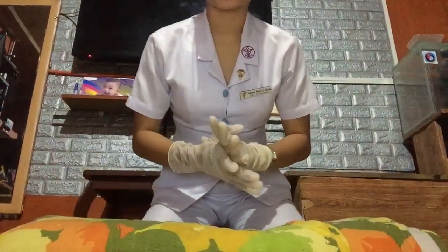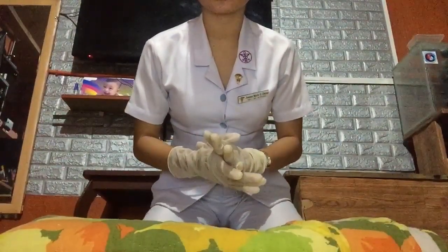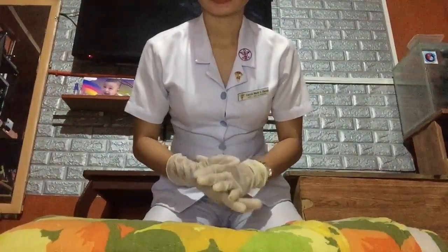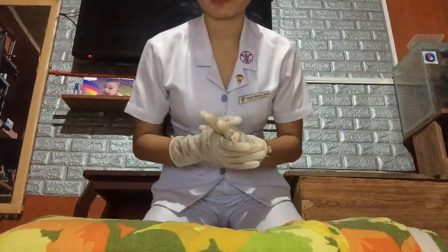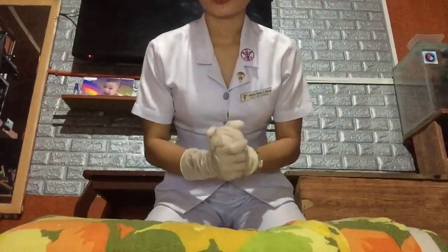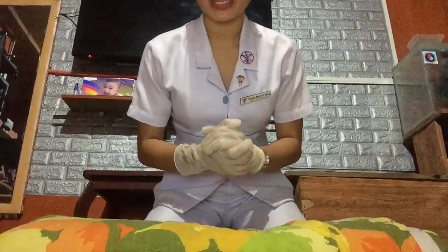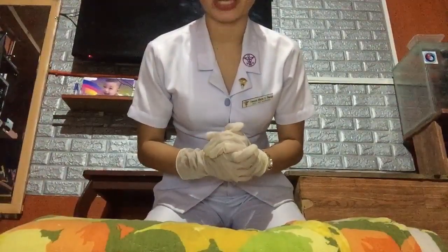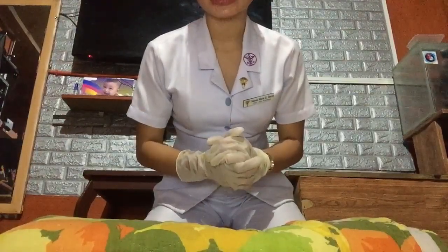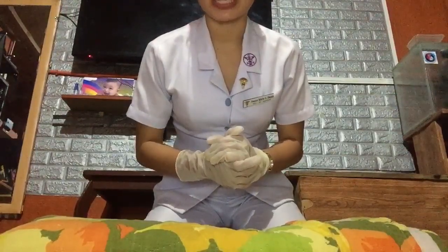Continue doing the chest compressions and then proceed to the rescue breaths again until the AED arrives or until an emergency responder arrives to take over. So proceed with the AED skills until the AED arrives. Continue the chest compressions and the rescue breaths until the AED is ready to analyze.